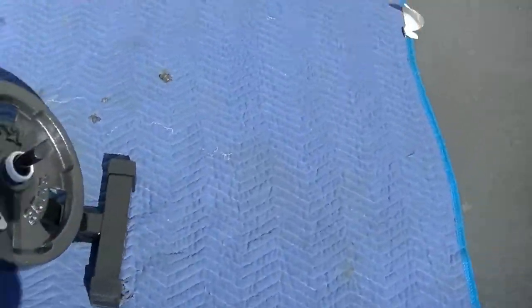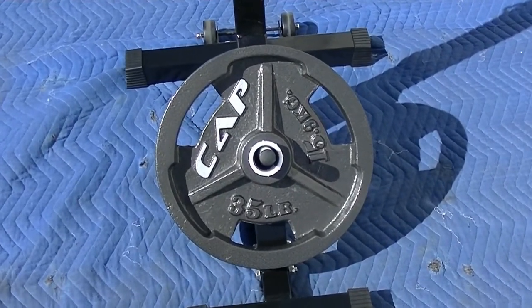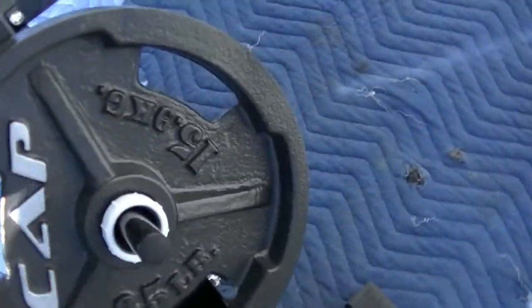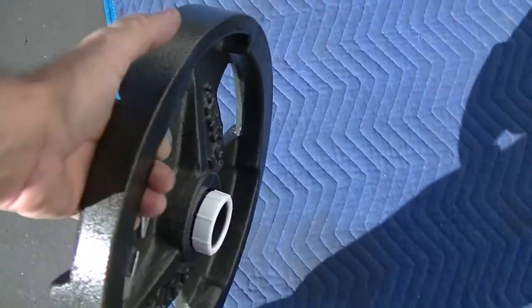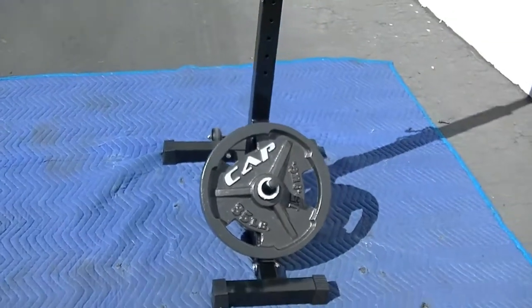The key to the whole system is this 35-pound weight — that's what keeps the stability. It goes right over this peg and comes off this peg like this. It's very easy to put on and pretty easy to carry. Just bring it over, stick it right on here, and you're done.